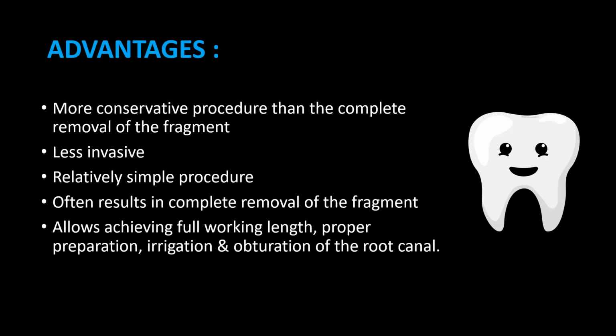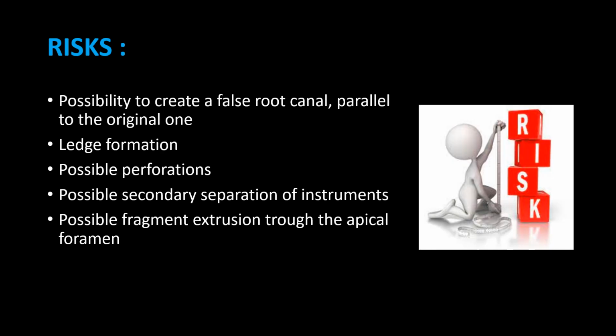Advantages: a more conservative procedure than the complete removal of the fragment. Less invasive. Relatively simple procedure. Often results in complete removal of the fragment. Allows achieving full working length, proper preparation, irrigation and obturation of the root canal. Irrigation can be activated under the EndoActivator, a sonically driven irrigation system designed to safely and vigorously energize the hydrodynamic phenomenon.